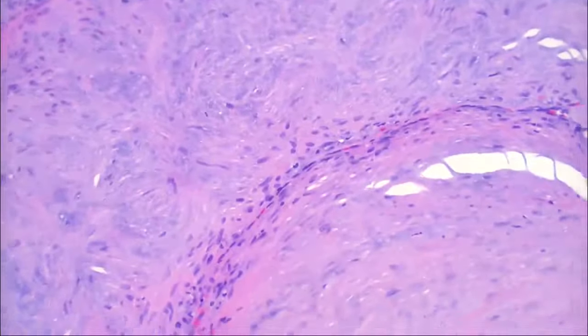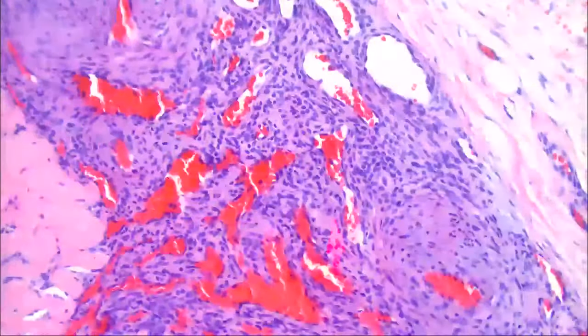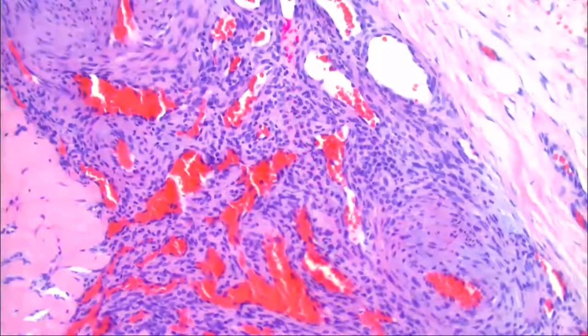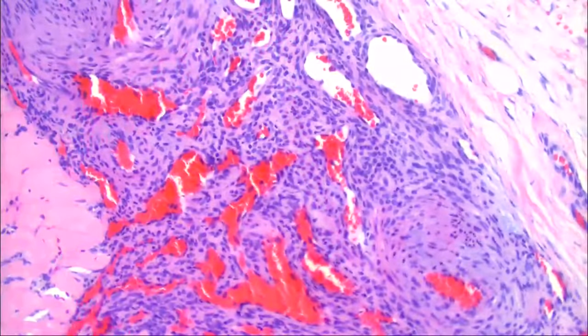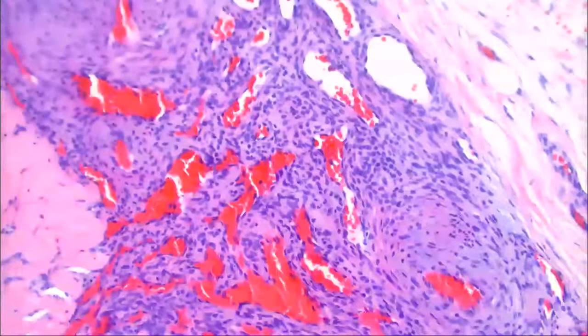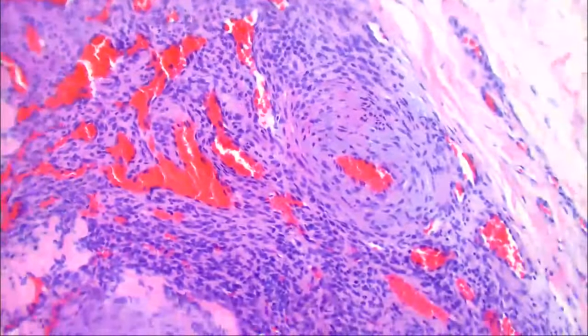Now what's this component? That doesn't look like myofibroma. No, it doesn't at all. The cells here look a little different from the others. They're more rounded. It doesn't look like inflammatory infiltrate. No, it's not. This is a more difficult one for dermatologists because they're not familiar with this entity. I think just popping to my head is endometriosis, those kinds of things, but that's smooth muscle and vasculature. I don't know if it's becoming pleomorphic. I know we said it was benign earlier.